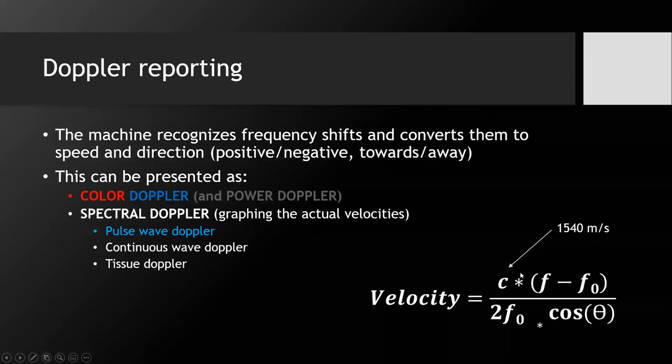And that is true with one caveat, which is if the patient has an arrhythmia, then beat to beat you might have different stroke volumes. So when you have something like AFib or another arrhythmia, you have to make sure that you're consistent, and the best way to measure your cardiac output is by averaging several VTIs. If you know that you're in normal sinus rhythm and you're getting a VTI that's different with two different hand motions, then you should go with the higher one because that's going to be your more accurate one. I have to think about the calculus and the equation. I could be wrong, because still your velocity should be lower regardless.